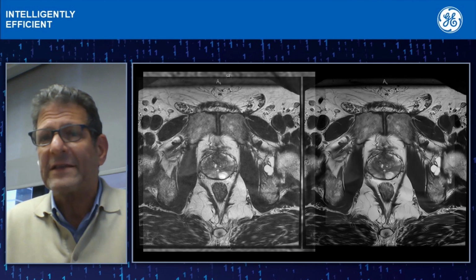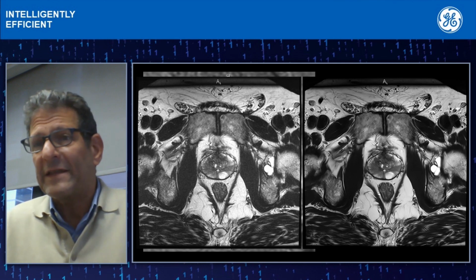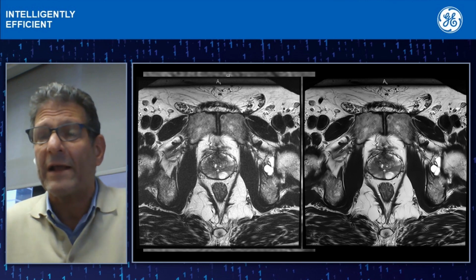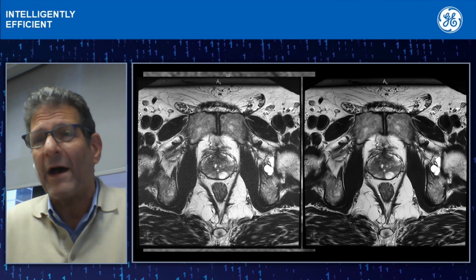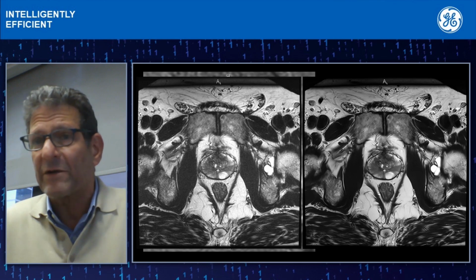And one of the things that higher resolution does for you is it makes structures seem larger. Take a look at this example. This is the same example with and without the deep learning recon on it. One is the conventional recon, one is the deep learning recon. And you can see that the sharpness of the image is up, the contrast to noise is also up, and it's a much more pleasing image and much easier to read.